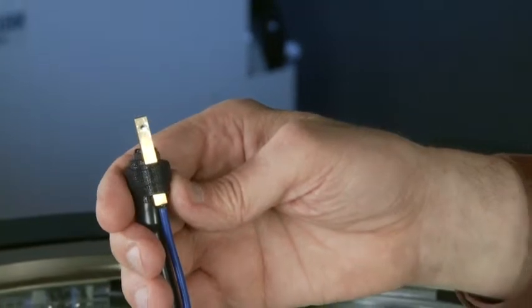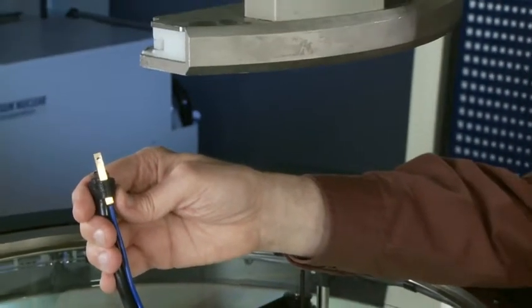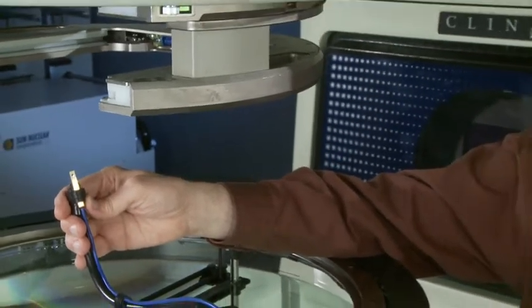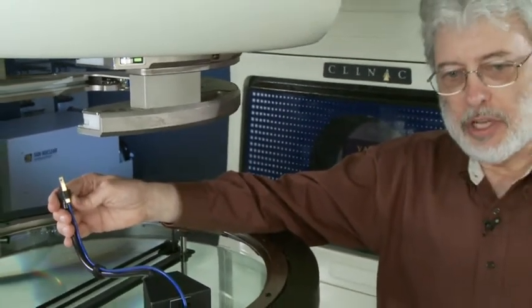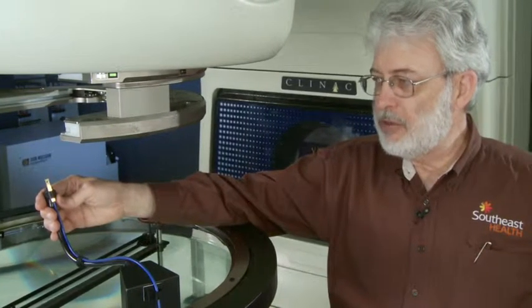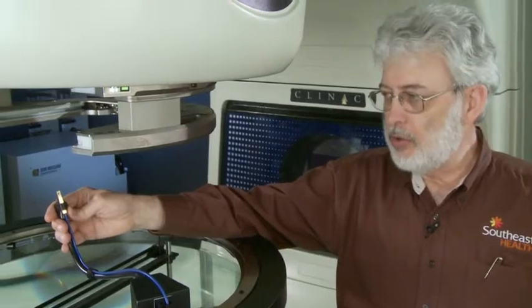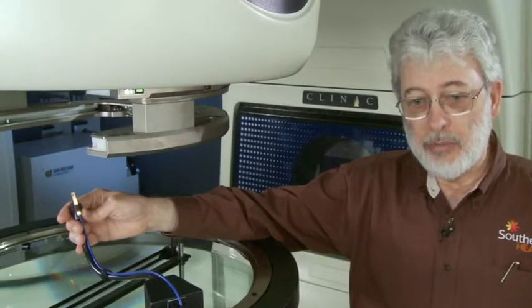One of the detectors I use for stereotactic measurements is this edge detector that's made and sold by Sun Nuclear. It's a diode detector that's energy compensated that will provide measurements for field sizes up to a 10 by 10 including depth dose that match the measurements from ion chamber.